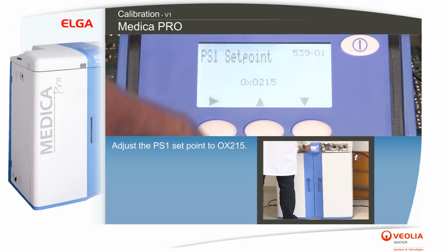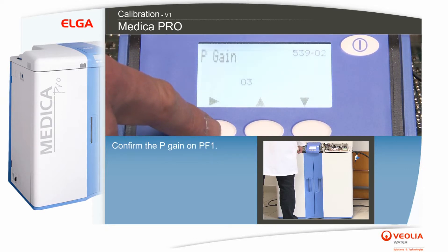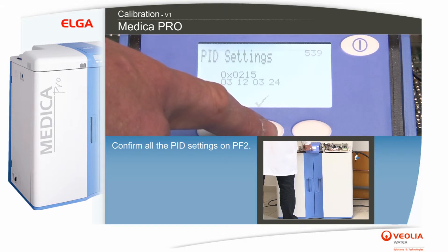Adjust the PID settings with PF1. Adjust the PS1 setpoint to OX215 and press PF1. Confirm the P gain, I gain, and D gain each with PF1. Confirm the PID limit with PF1. Confirm all the PID settings with PF2.